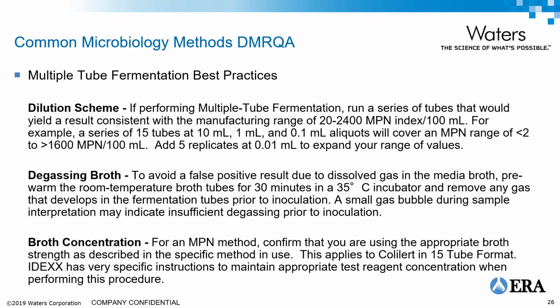If by chance you're someone who is doing Colilert in a 15 tube format, you want to make sure that you follow IDEXX's instructions very closely. They actually have it set up so that they maintain the appropriate strength within the tubes.